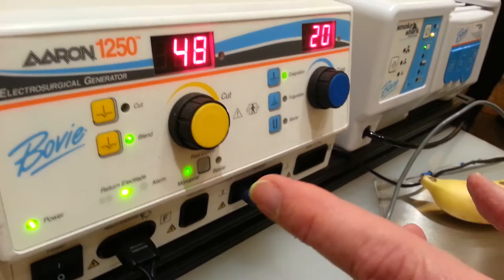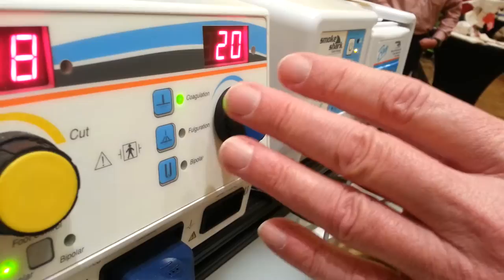I have a blend, which cuts and right behind it, it coags. And then over here on the right side, I have two coag functions.